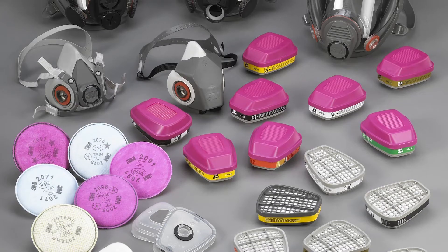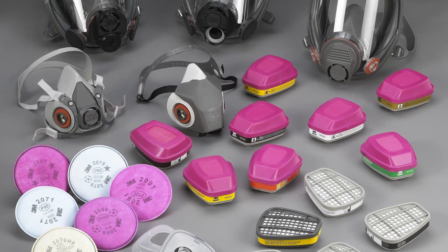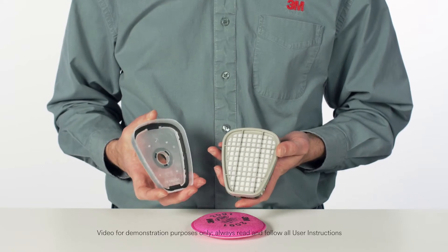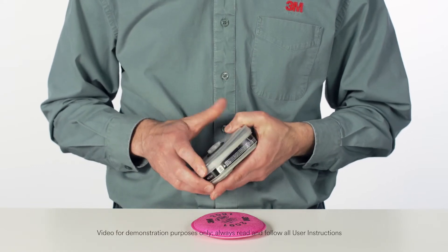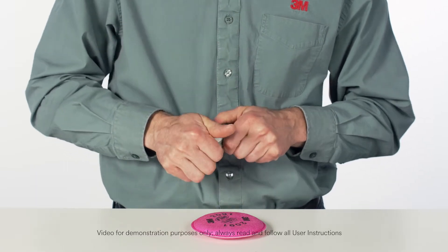3M Full Facepiece Respirators are designed to be used with a variety of 3M bayonet attachment chemical cartridges and particulate filters. If you have any questions about which cartridges and filters are appropriate for the respiratory hazards you encounter, consult your supervisor.